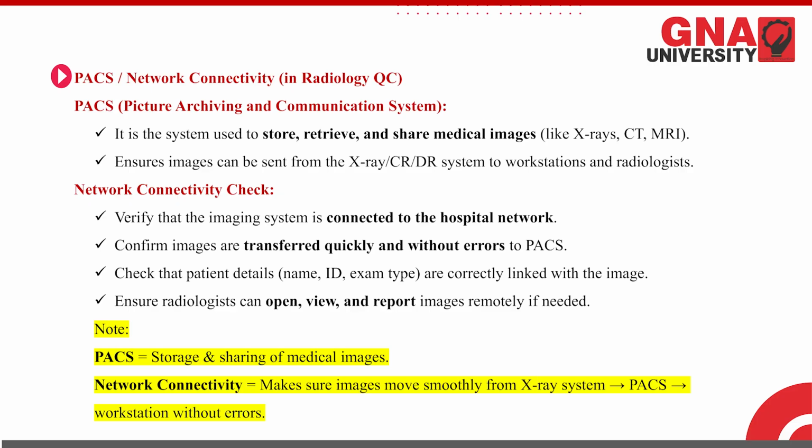It is used in X-ray, CT, and MRI also, and ensures images can be sent from the X-ray, CR, and DR systems to the workstation and radiologists. We have to ensure this for diagnostic purposes, for checking purposes.